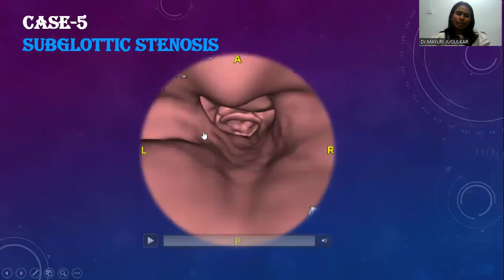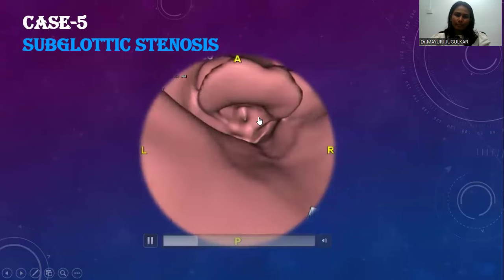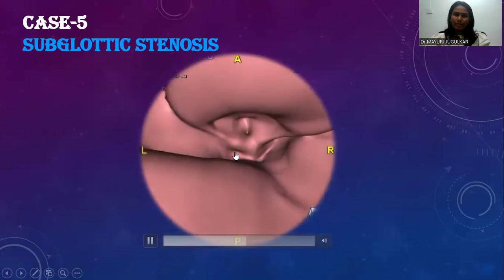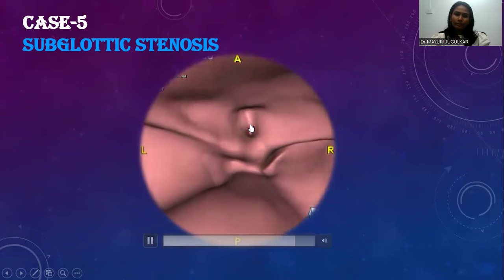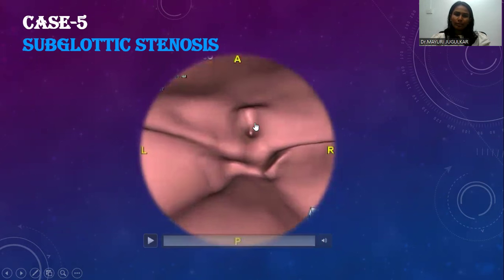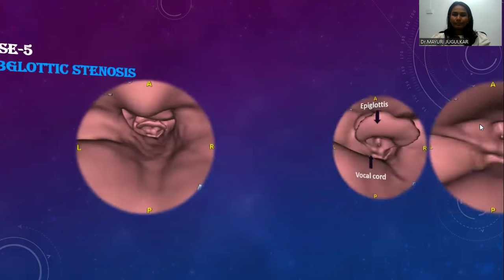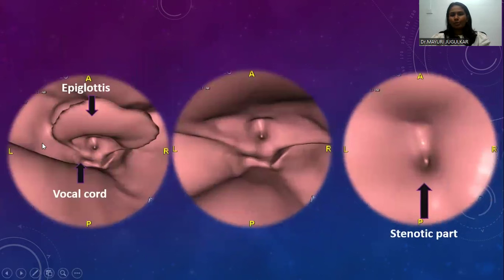This is another case showing subglottic stenosis. This is the epiglottis, vocal cords, and this is the stenotic part. These are images of the stent.